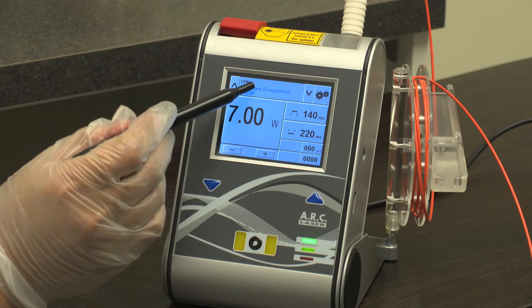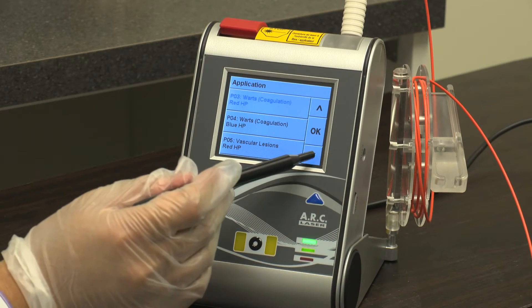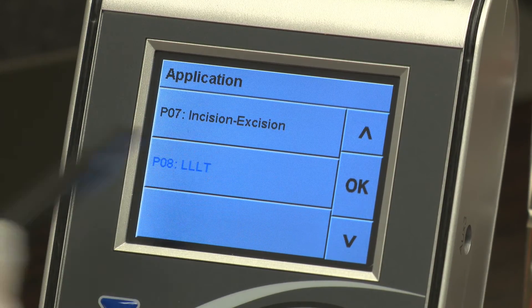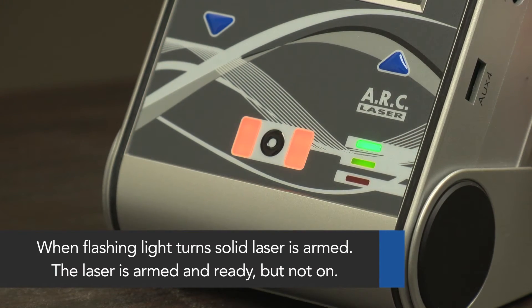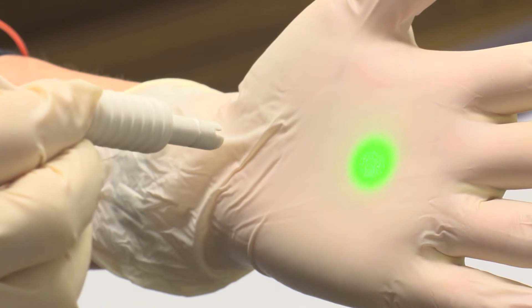To begin, power the device on and ensure proper settings. The correct setting for treating plantar fasciitis is labeled LLLT. Next, arm the laser by putting it into ready mode. The laser is armed but not on when the light is solid. The aiming beam will also appear when the device is in ready mode.